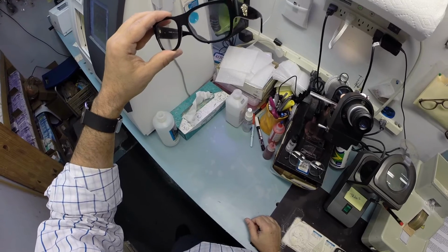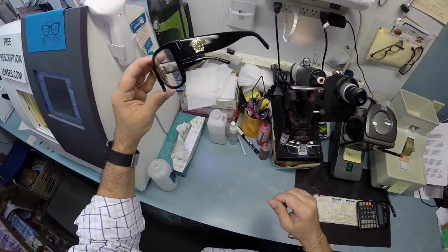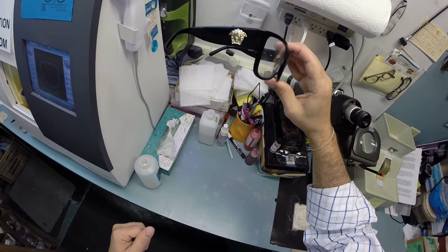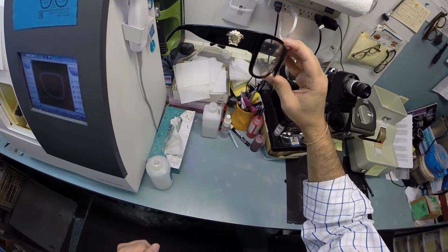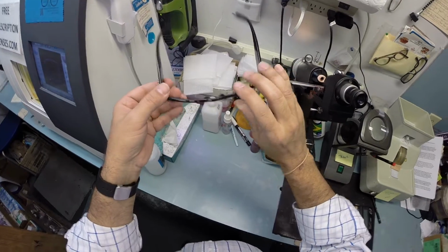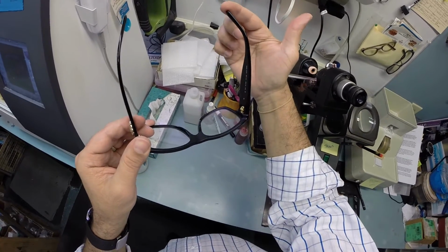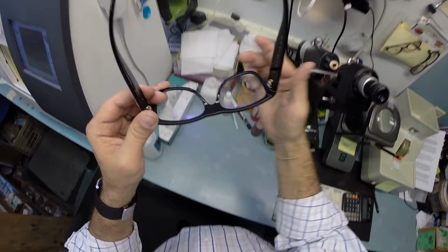But because of that statistic, 99% of all optical shops will do free adjustments if you ask them. So just stop by your local place and they'll get them adjusted for you. It only takes about 30 seconds to a minute to adjust a pair of glasses. But I'm going to get them in standard alignment first, also known as a three-point stance. The three-point stance are 1, 2, and the bottom of the frame being 3.